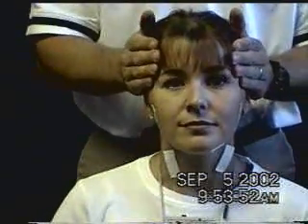Now that we're done placing the electrodes, we just want to go through real quick and make sure they're all pressed on nice and tight. We have clean, dry skin, and now we're ready to place the EMG wires.